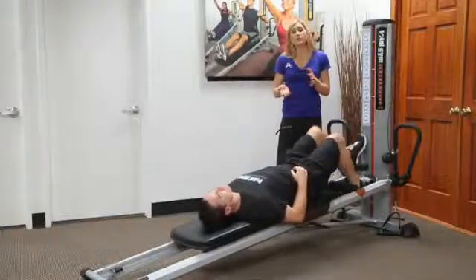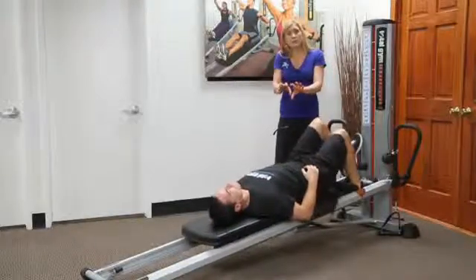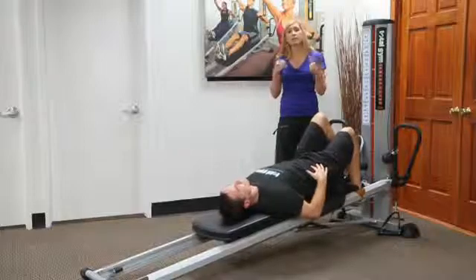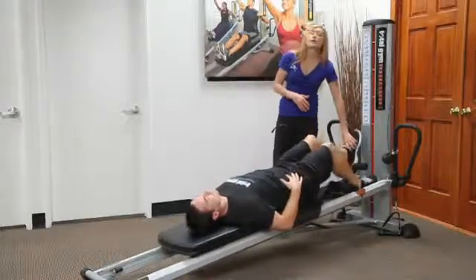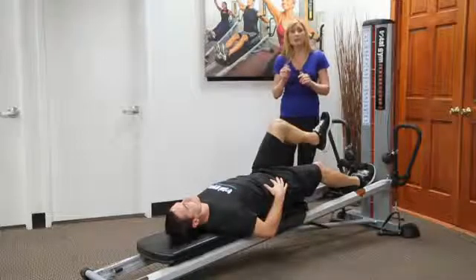So we're going to transition a little bit in that thought of in this position to strength and move a little bit into the awareness section, because I might be doing the same thing but my intention is different. For instance, maybe he has his foot here to self-spot and make the resistance less. I might also bring his foot here because maybe he needs to have a little bit more stabilization in the back.